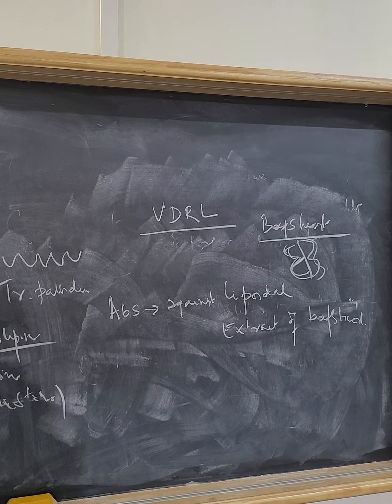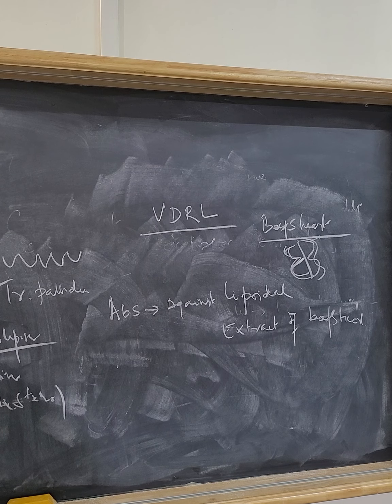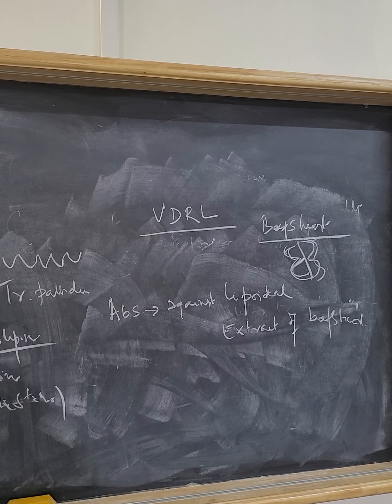Lecithin and cholesterol are added to cardiolipin, and these lecithin and cholesterol are called flocculating agent.